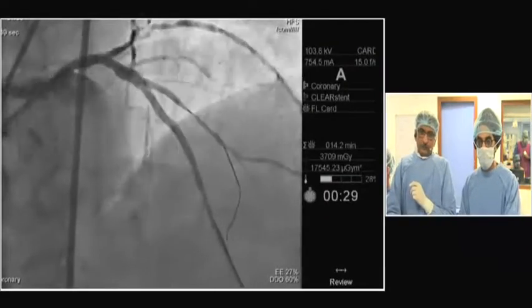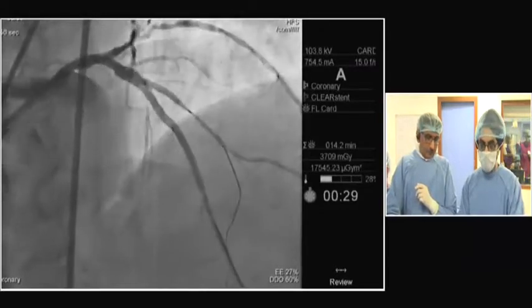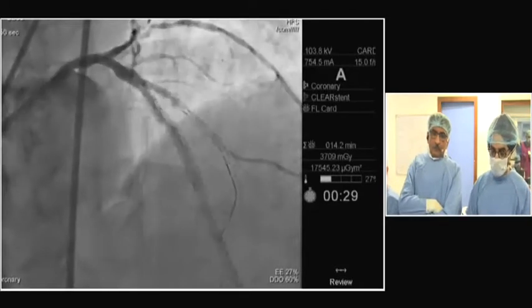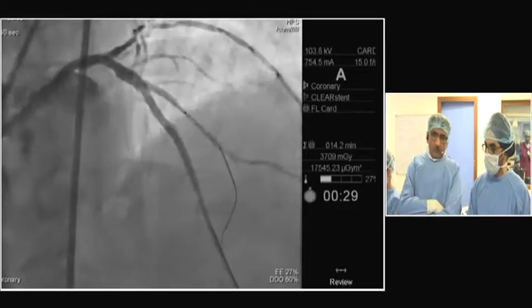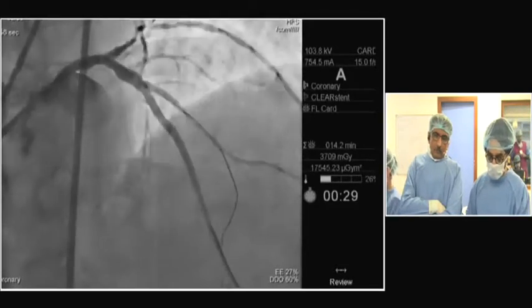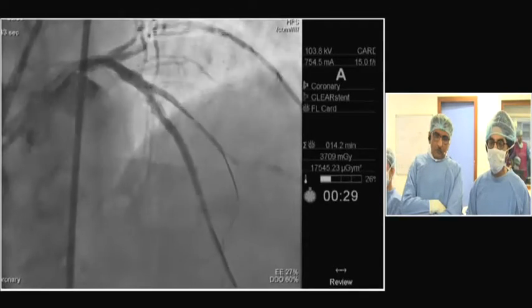But this diagonal is important. There is a question always in a... Yeah, the question, so, Kenny, one point here. I think it's also very important to make sure that we have at least 6, 7, 8 millimeters of stent in the proximal main vessel so that we have room to do the POT. Because if we do the POT within a 3, 4 millimeter stent in the main vessel, then we end up injuring an uncovered area in the main vessel, which may be a reason for stent restenosis.